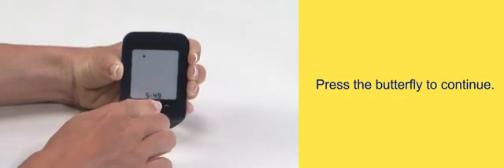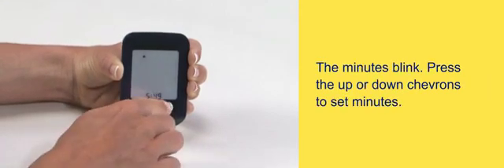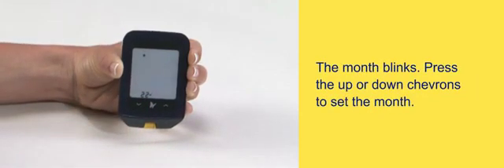Press the butterfly to continue. The minutes blink — press the up or down chevrons to set the minutes. Press the butterfly to continue. The month blinks.